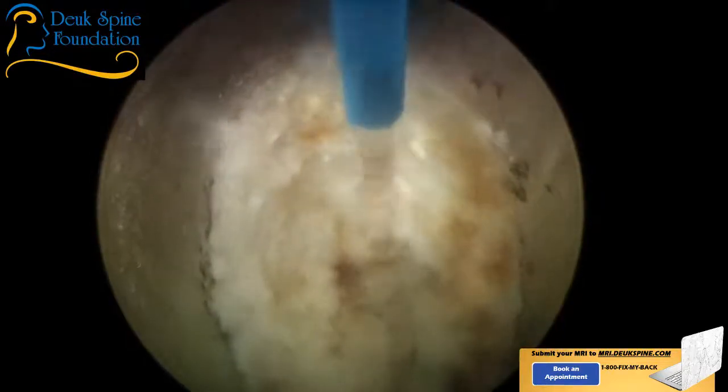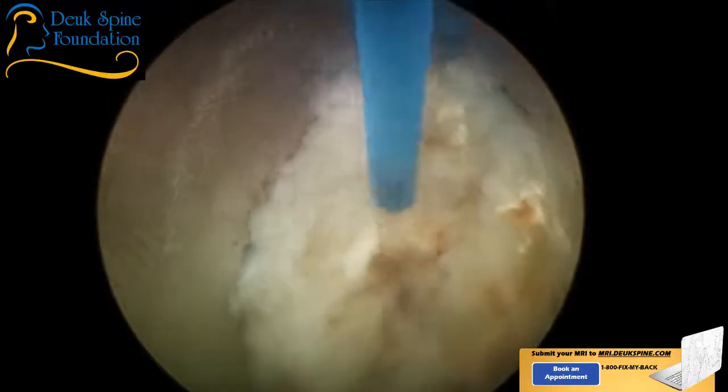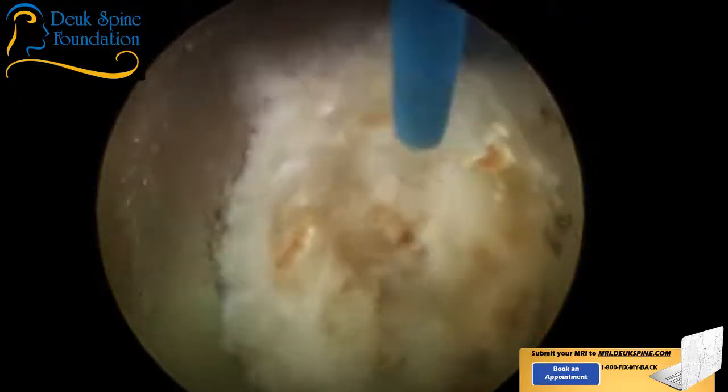Cam is here helping me today. Luis is running the laser. And we have a wonderful anesthesiologist who's helping us.